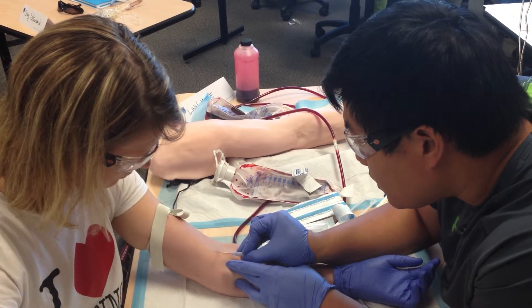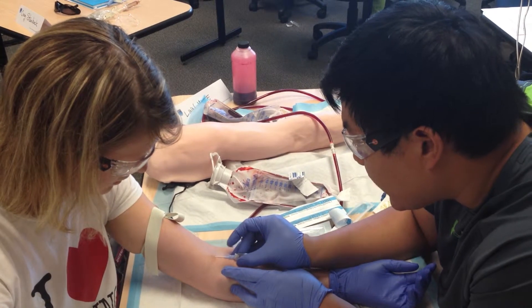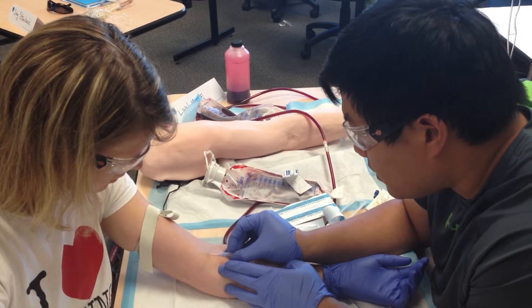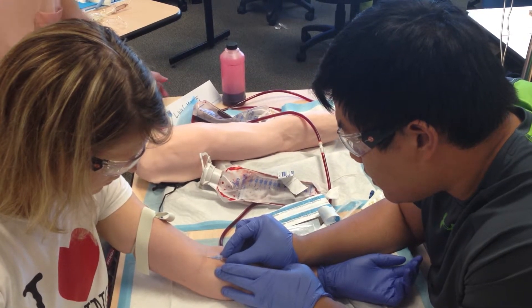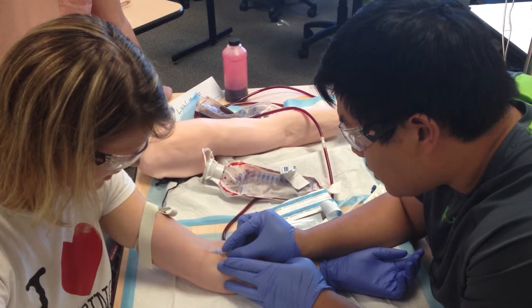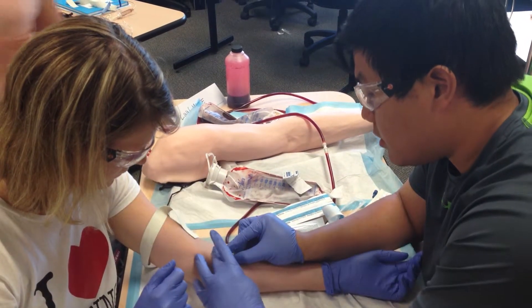Do we have to change it if we take it off? No, you get flash. Okay, good. Now, decrease your angle. Feed it in. Nice. Excellent. Good job.